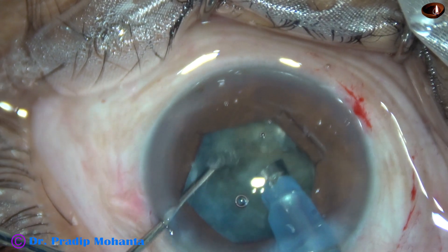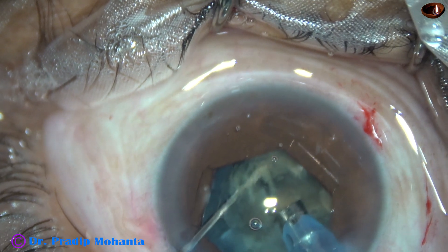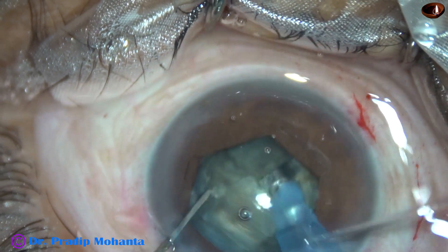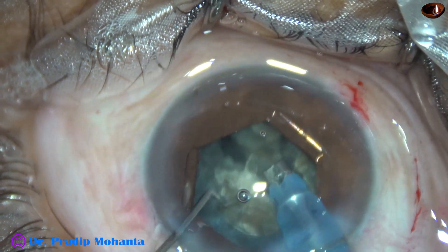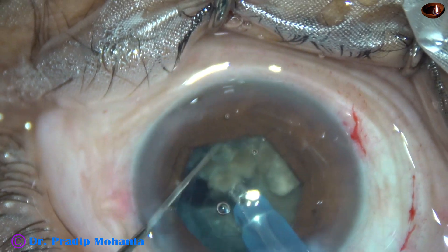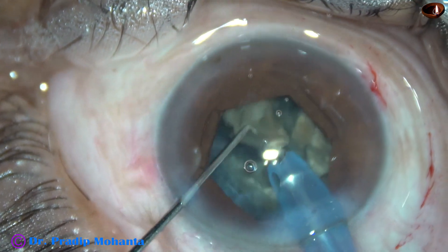Now I am trying to chop this hemi-nucleus and I could do it very nicely. I rotate the nucleus further — this nuclear fragment is now free. I rotate 90 degrees more, hold this space and separate the two hemi-nuclei completely. This is the other hemi-nucleus — same principle: go through the substance of this cataract and chop. We have got four large free nuclear fragments. I tilt each nuclear fragment and start emulsifying from its apex.